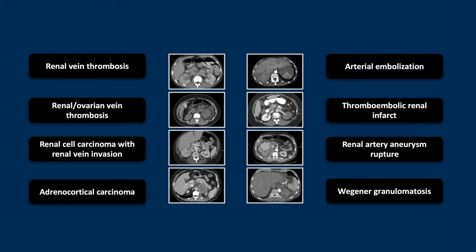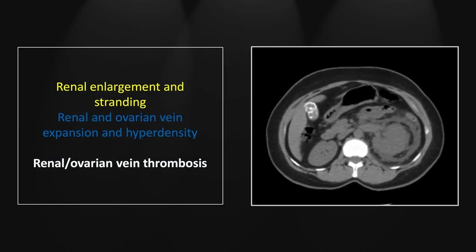Our next case is a renal and ovarian vein thrombosis shown on a non-contrast scan. There's obviously extensive perinephric fluid and stranding suggesting some renal pathology. There is significant enlargement and hyperdensity of the left renal vein, allowing you to make the diagnosis of renal vein thrombosis even on this non-contrast study.